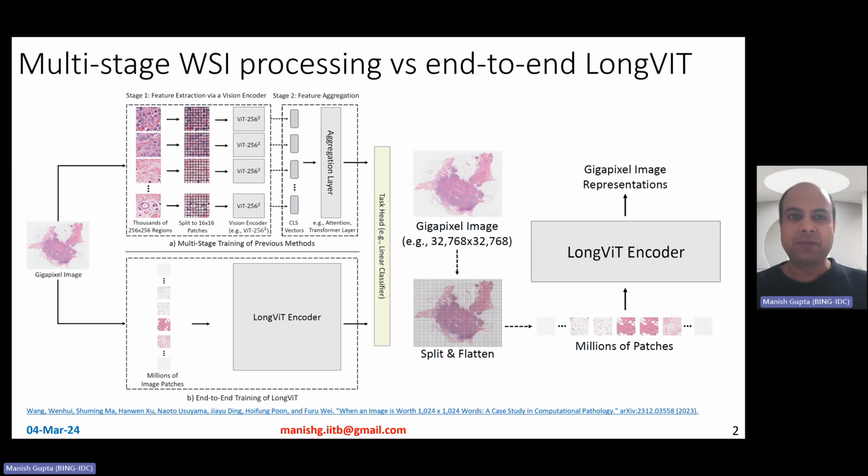I myself worked on computational pathology for some time, and the way this works is essentially, let's say, if you have a particular pathological sample, you first build a microscope glass slide out of it. I mean, the same kind of microscope slides that we experimented with in school days, right, in biology classes. And then the doctors actually spend about 30 to 40 minutes looking over the entire glass slide so as to figure out if this person has cancer or not, or figure out the grade of cancer and so on based on the tissue, which is smeared on that glass slide.